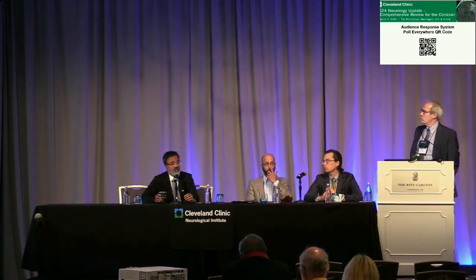The occurrence of a single discharge lasting less than a second by themselves, and that's the only thing that I'm seeing, I will not use that as a way for that. It just basically tells us that he or she has epilepsy. It doesn't mean necessarily that they're having disabling seizures. So that's the question: are they or not having disabling seizures in terms of driving?